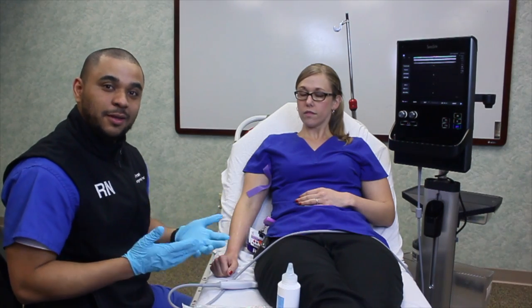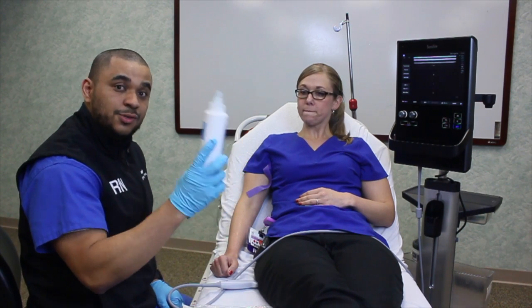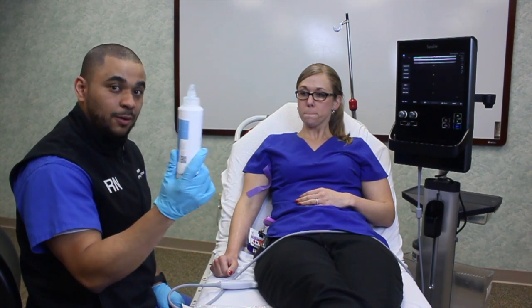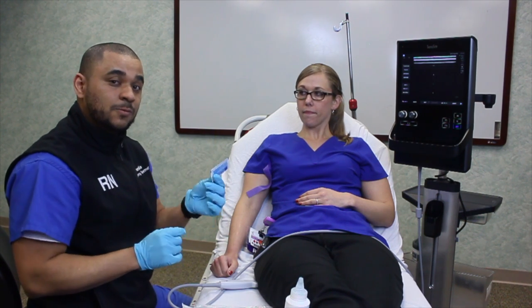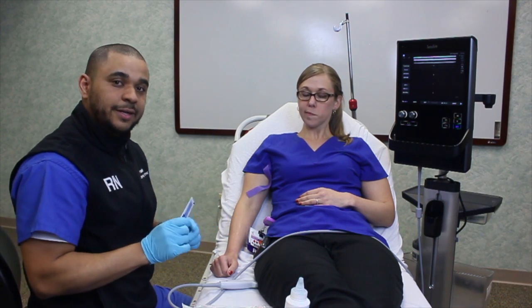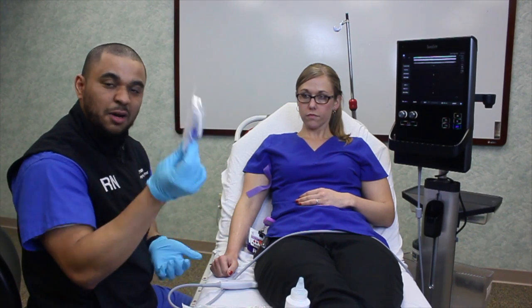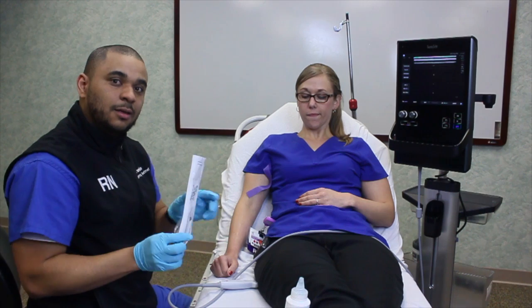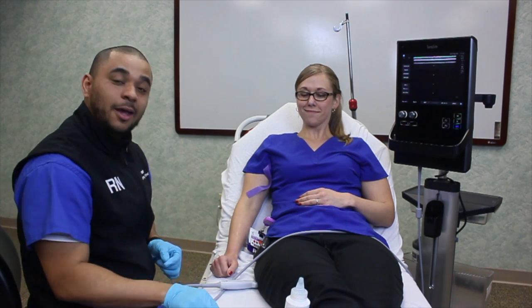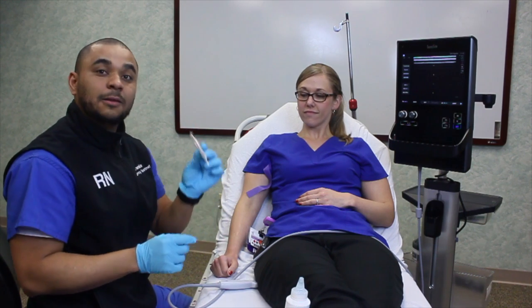Let's slow down and recap. The multi-use gel is only for scanning and exploring the upper extremity. The single-use sterile gel is what we use once we decide to insert the angiocath. You'll also need your regular IV start kit, your flush extension set, and a long 20 gauge needle — approximately one and three-quarters inches long.